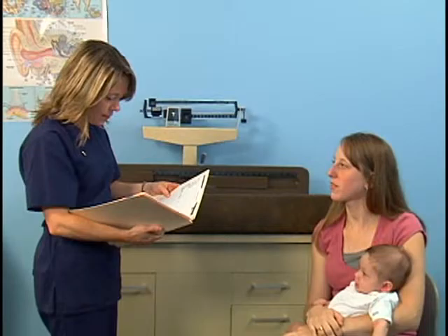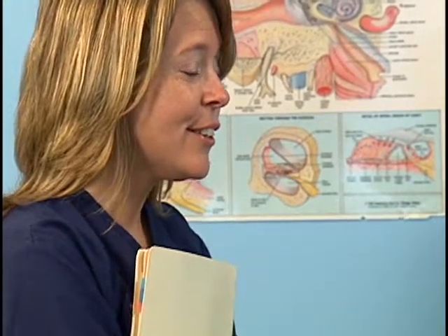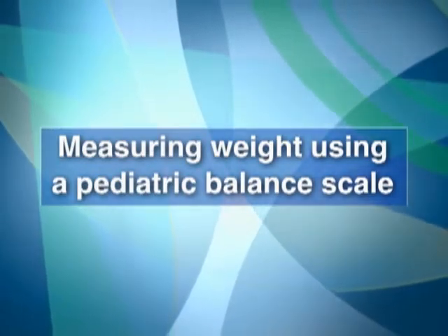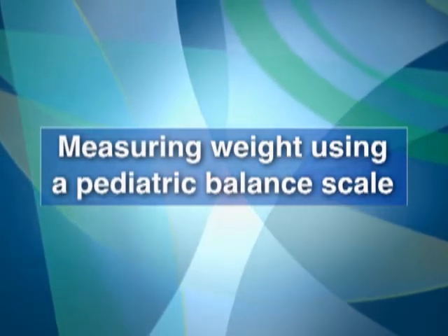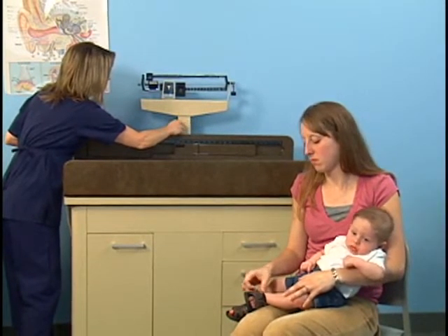Depending on the medical office policy, ask the parent to remove the infant's clothing and put on a dry diaper, or remove the infant's clothing, including the diaper. The weight of the infant is usually measured first. Unlock the pediatric balance scale and make sure there is a clean paper protector on it. The paper protector prevents cross-contamination between patients.